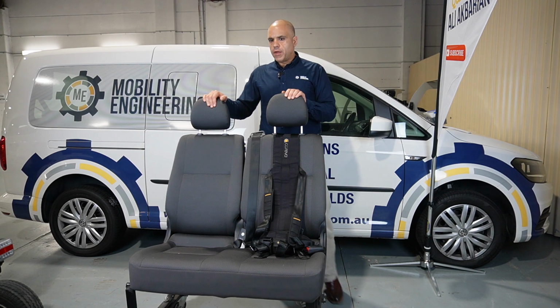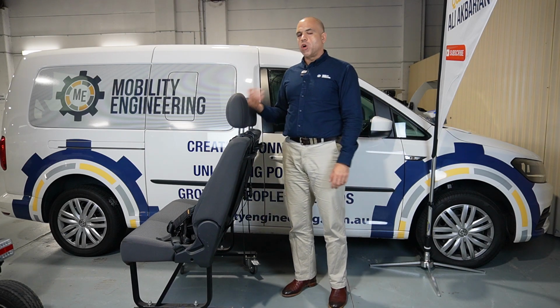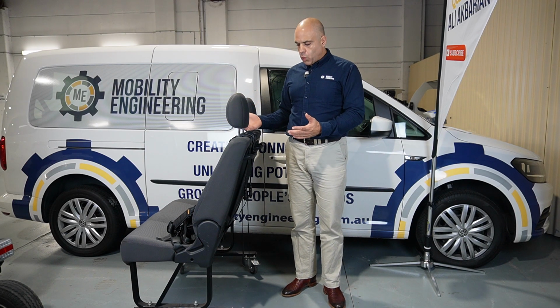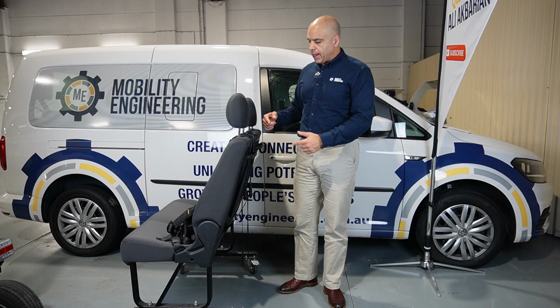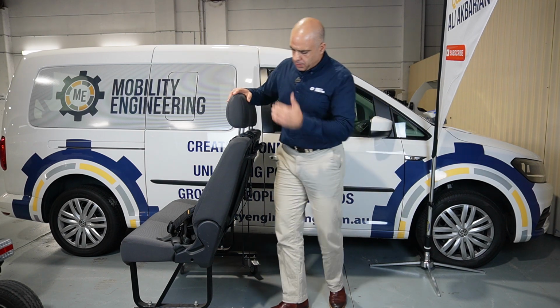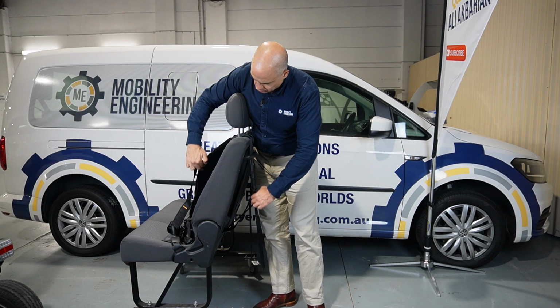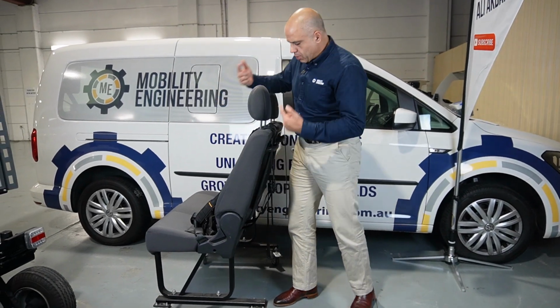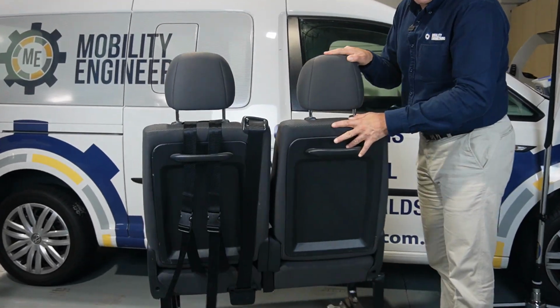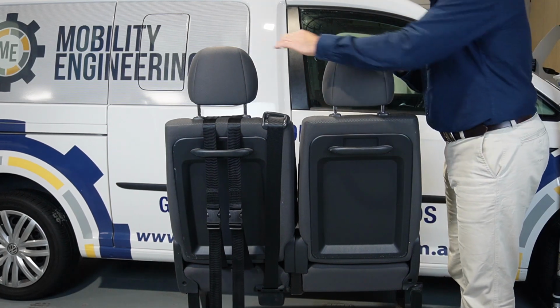The reason why this question has come around, before I go on and answer it, is because the majority of these harnesses, almost every single one of them, have a design where they wrap around the seat. So I've got this seat frame here and the seat back here, and you can see this thing here is basically a loop that wraps around the seat back. It comes around on the back of the seat like that, right? This is the design of all of these products.